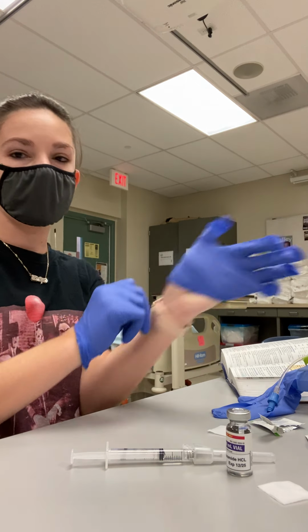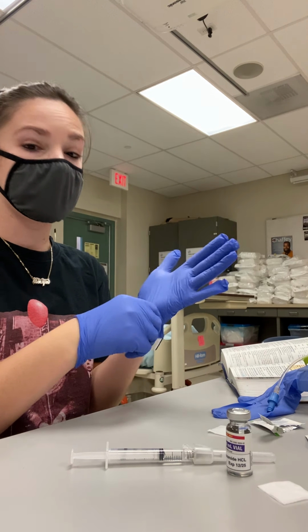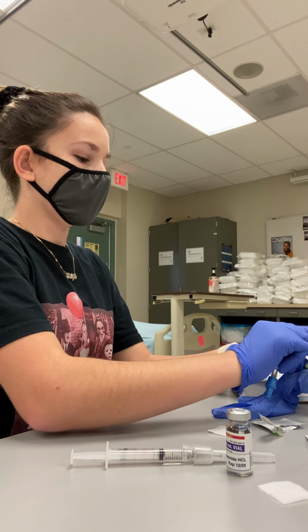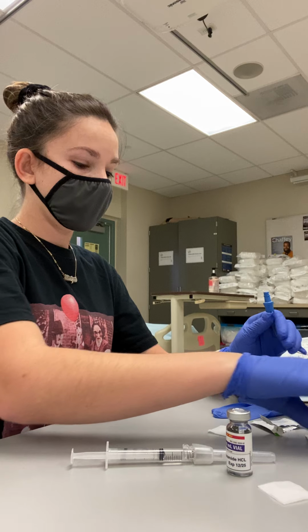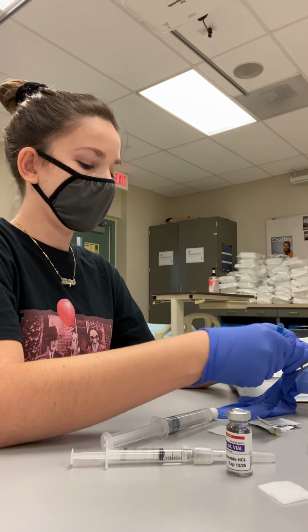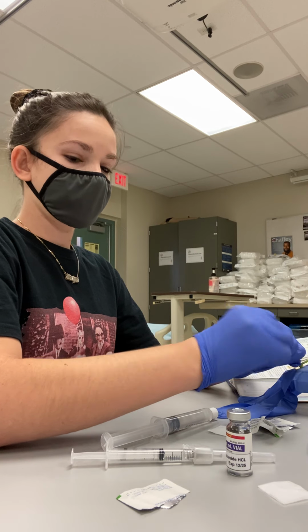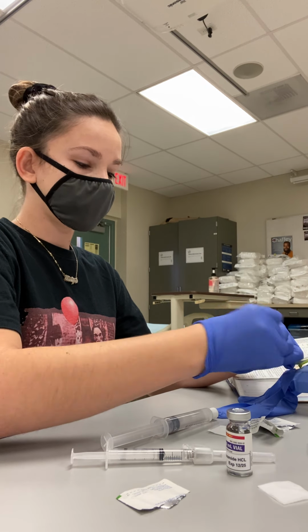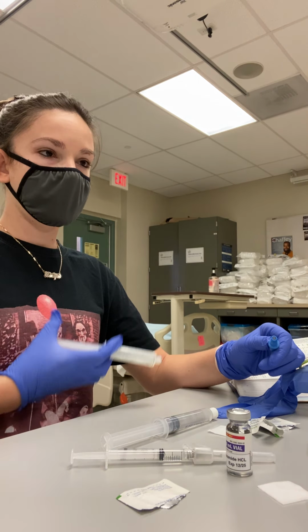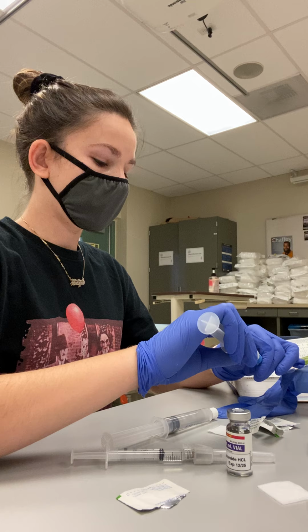Assess the IV site. Assess the IV site for redness, swelling, edema, drainage, and infiltration. Site looks good. So you will first clean the hub, scrub it. Apply the 6 ml. So I will open it, and again, I will push for 4 minutes. And you will prepare 0.75 every 30 seconds.